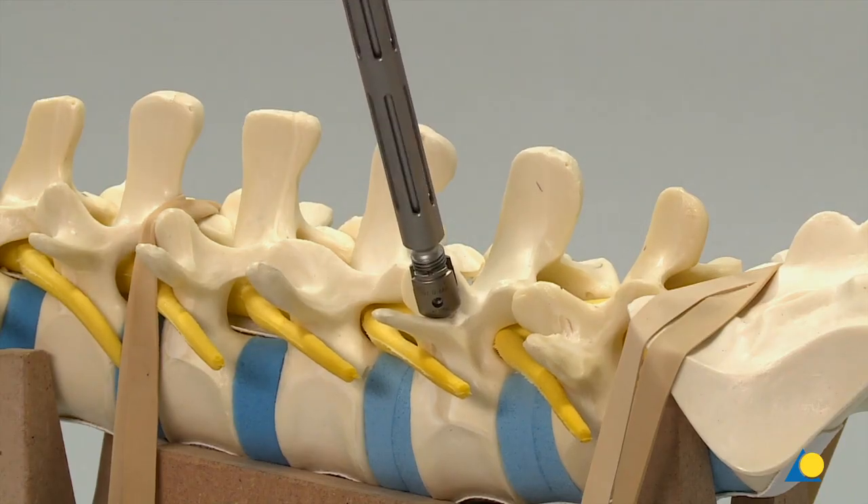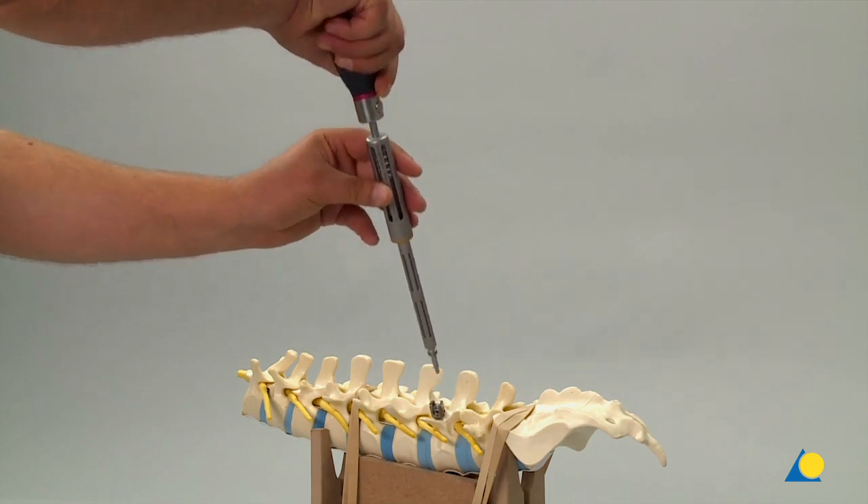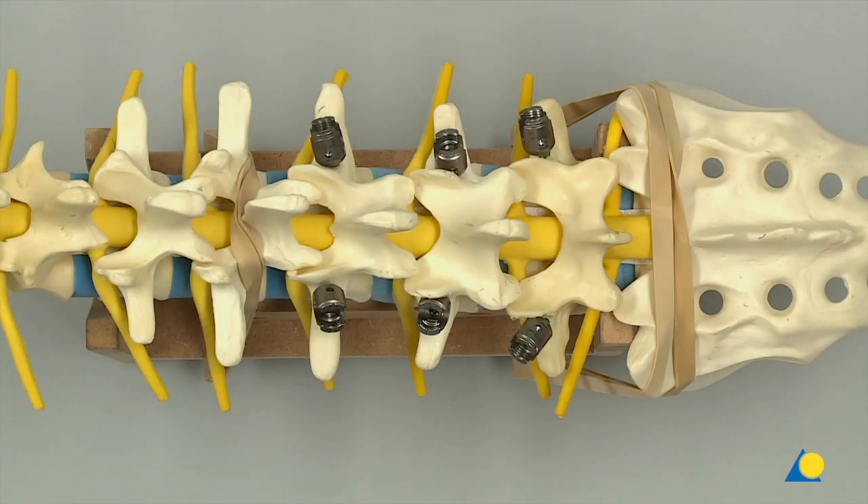In a clinical situation, at any point in the process, radiographic confirmation can be obtained. Five remaining screws are inserted in the same manner.